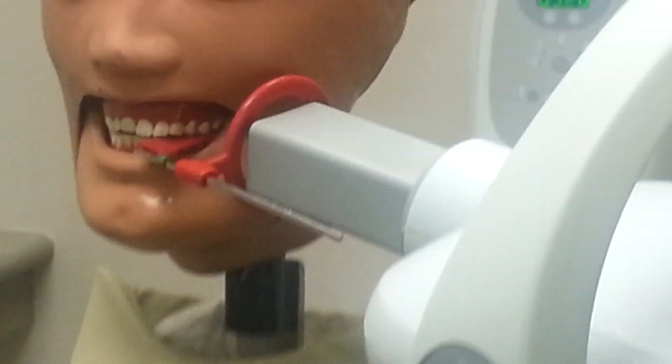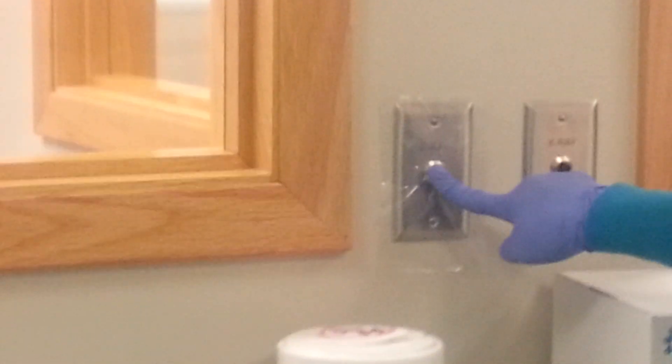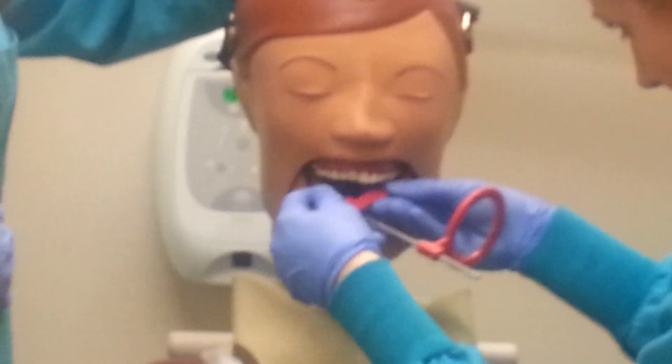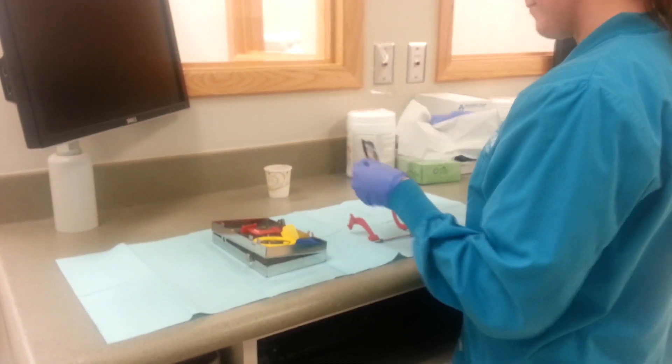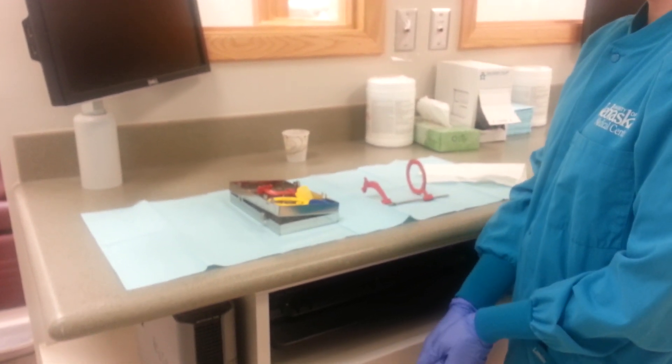Once you have the X-ray unit positioned correctly, make sure the patient understands they cannot move. Leave the room and hold down the exposure switch until the beep stops. You may then go back into the room and remove the phosphor plate and XCP from the patient's mouth. Remove the phosphor plate from the bite block, dry it with a tissue, and place it in the cup. This process is repeated on the opposite side of the mouth. Once you have taken all your radiographs, you are now ready to process the images.